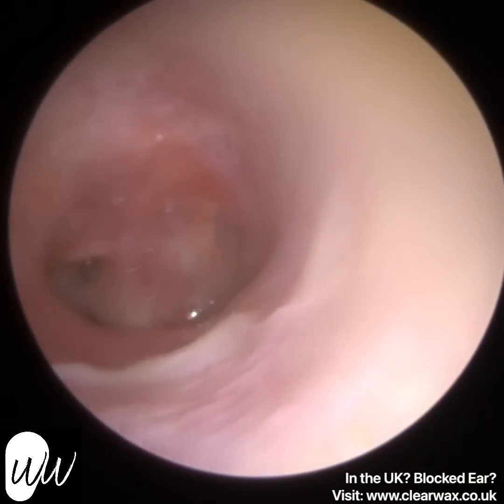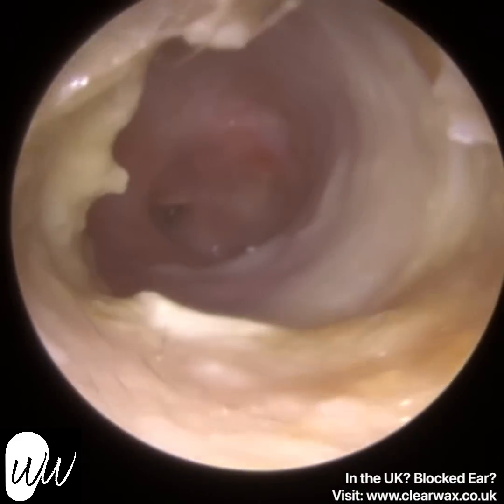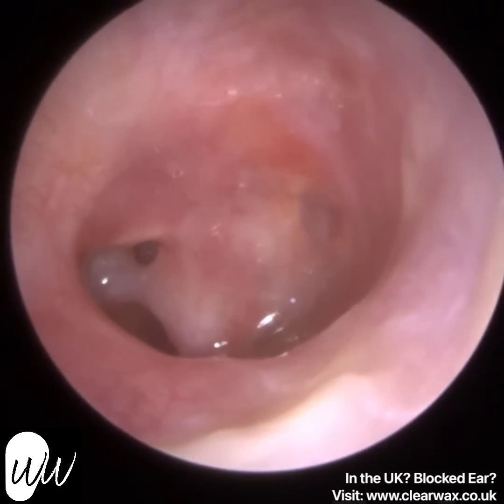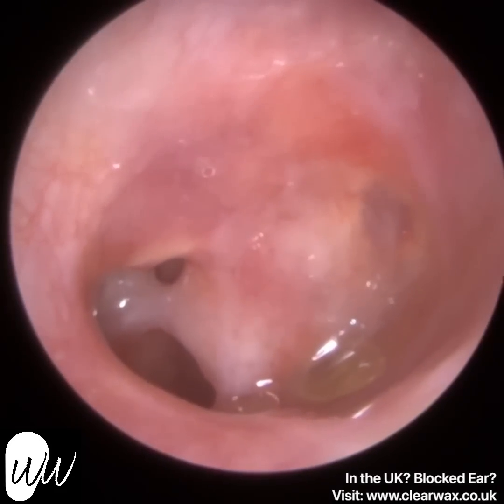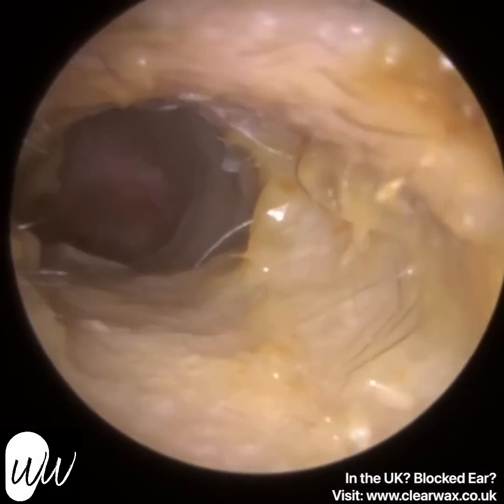So I've just about managed to insert the endoscope into the ear, but it's just got a bit blurry because of the infection. There's a bit of dampness around the ear, so I just wiped the lens and I've just gone back in. And that's the patient's eardrum, believe it or not. Now, obviously it doesn't look like a normal eardrum. There's a bit of discharge at the bottom. I am going to just mop that up.